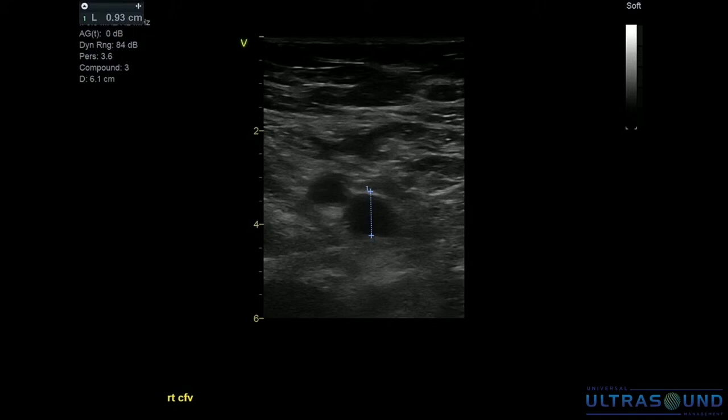That's why it's important that we adhere to our diagnostic criteria as far as thrombus staging, and make sure we communicate that with our medical director, because not all the time we're on the same frequency as far as the criteria chart. So it's important that we nail that down with them as well. Anyway, I don't want to get too far ahead on that soapbox. Let's get back to Barbara here.